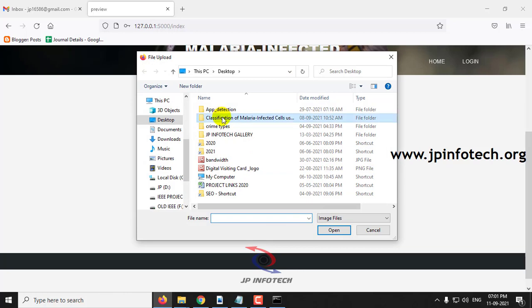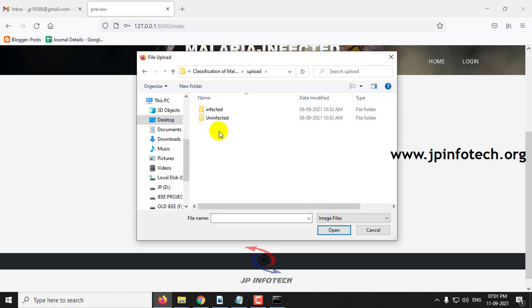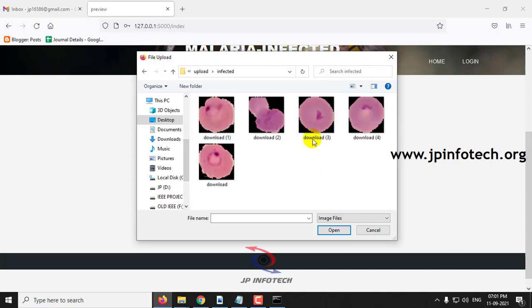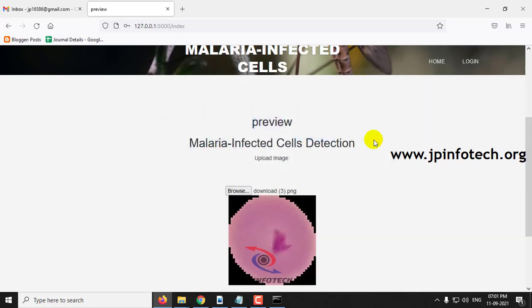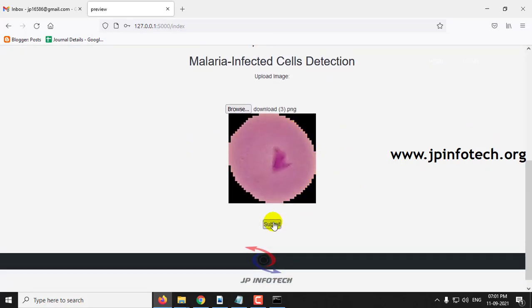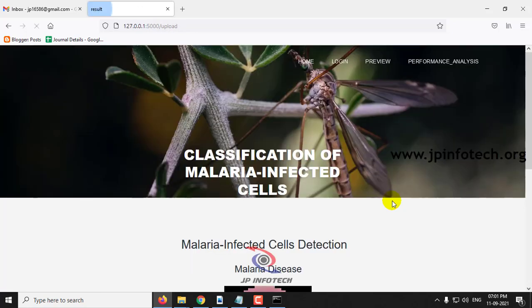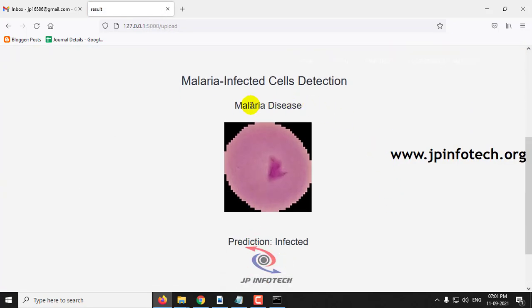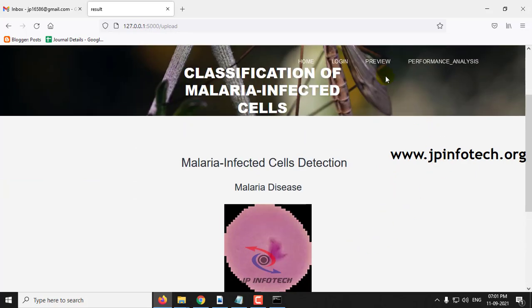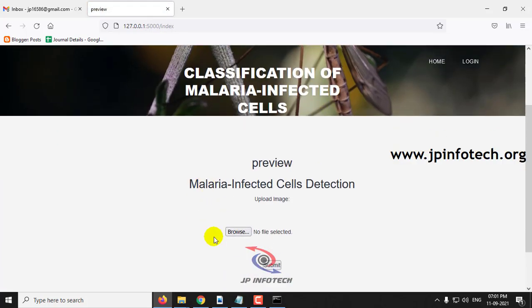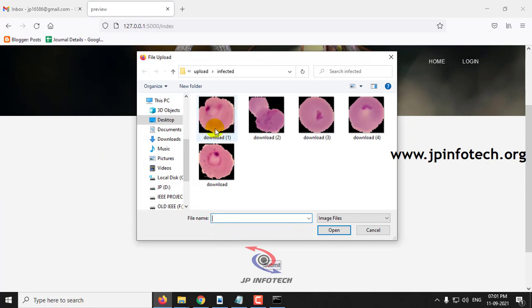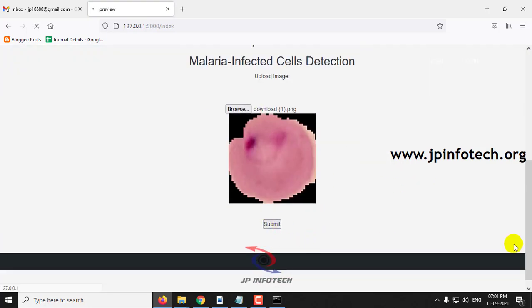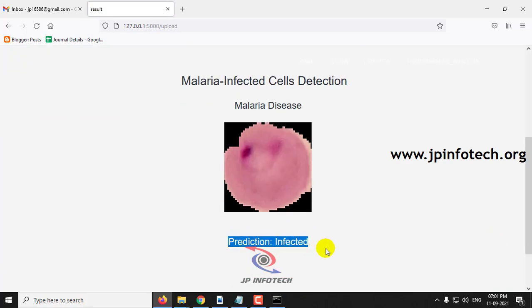Click the browse button and go to the source code location where you can see the upload folder containing two folders: infected and uninfected. Select the image accordingly. Let me go to the infected folder, select an image, preview it, and click submit for the prediction. You can see the prediction result is infected. Let me select another image, click submit, and again the prediction result is infected.